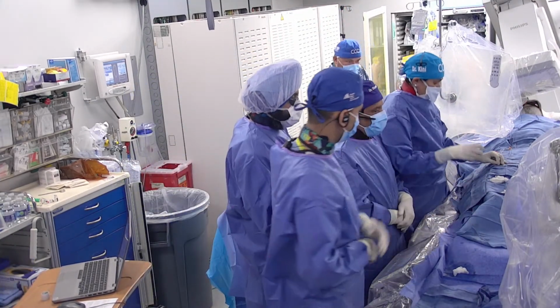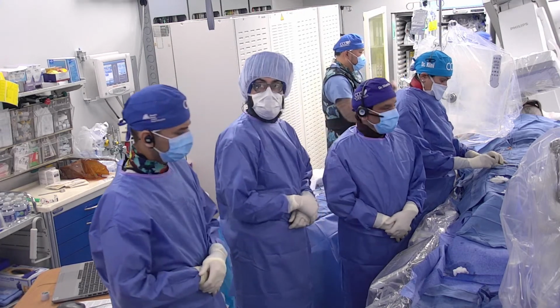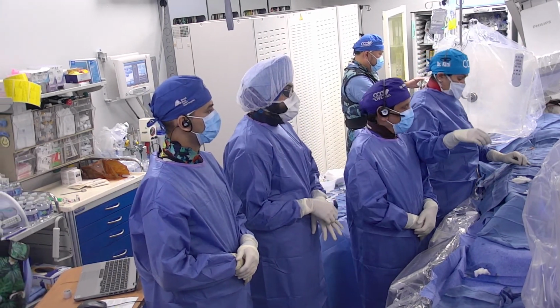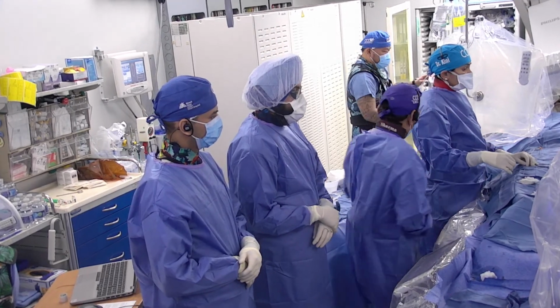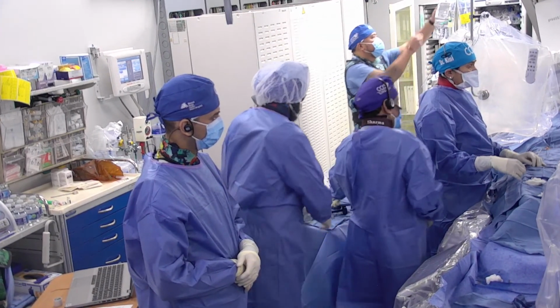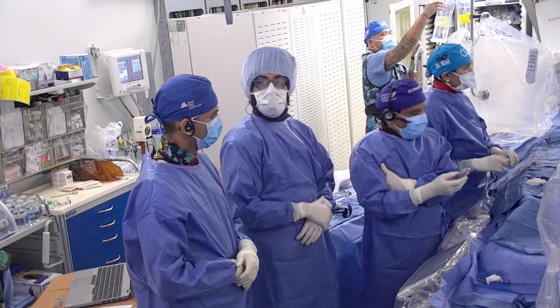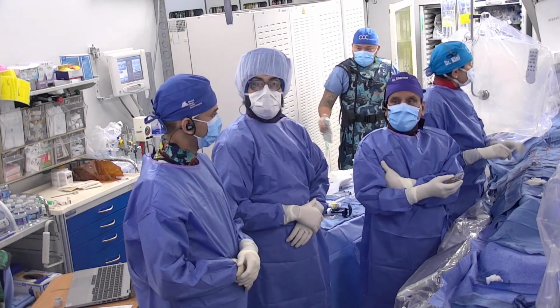We always keep coming with a challenging case, and this is the case with severe calcification of the branches, a few branches actually, D1, D2, and we'll see what we need to do. But there has been tremendous input. We still have a lot of demand for the retrograde case, so hopefully next month we'll do a retrograde.